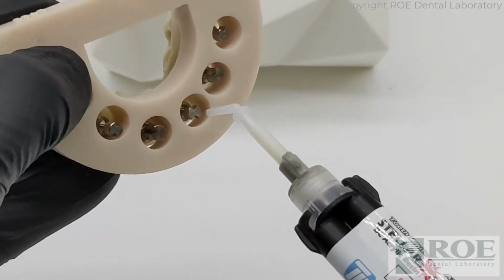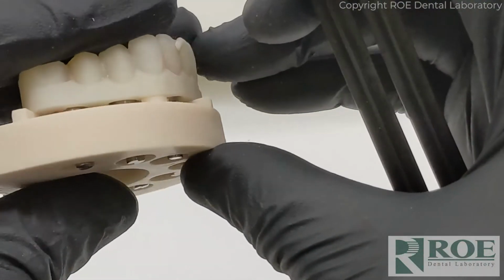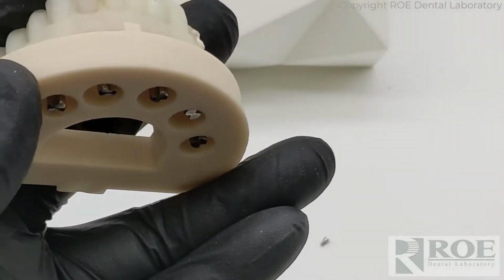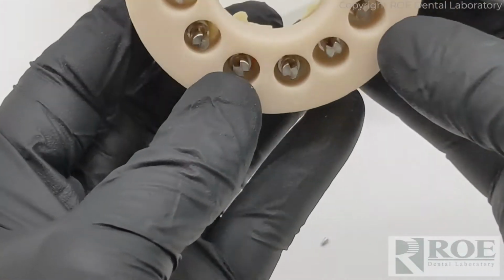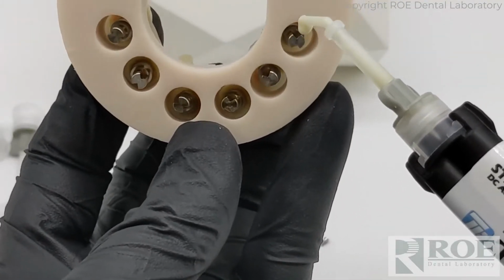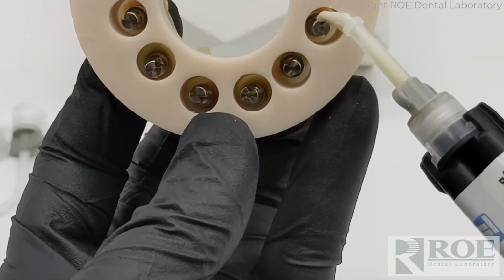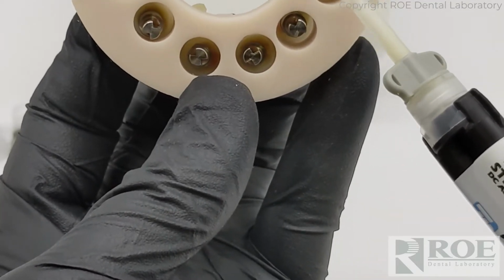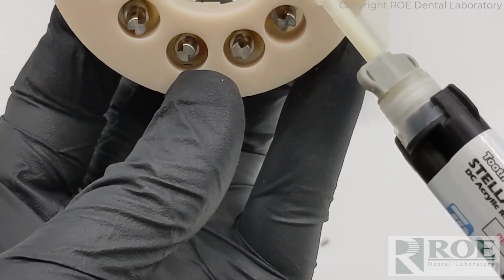So we'll talk our way through this whole process here. You want to make sure that it's down. You see how it popped up? So you want to make sure that it's completely down. One of the important things with this, and I'm going to hold it this way because some of these copings are closer to one end, well, actually it doesn't really matter because they're about in the middle. So the point of this process is to connect the coping to the model.